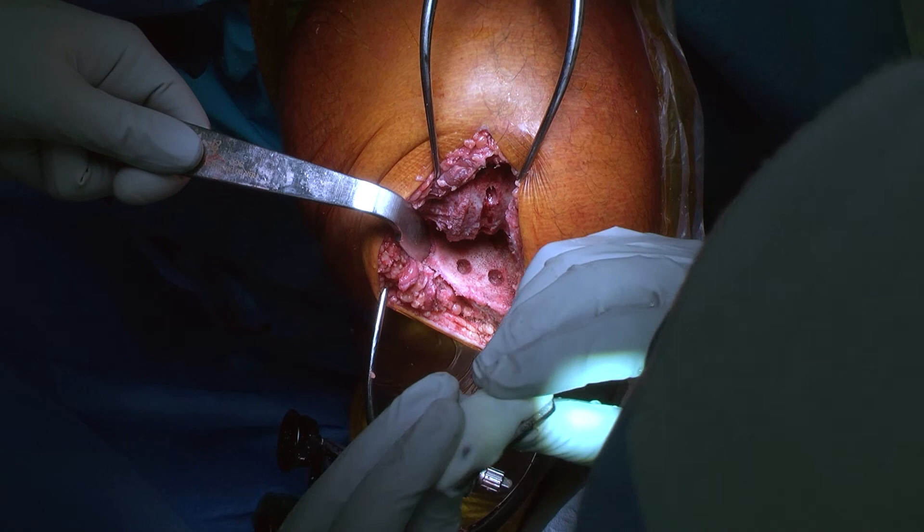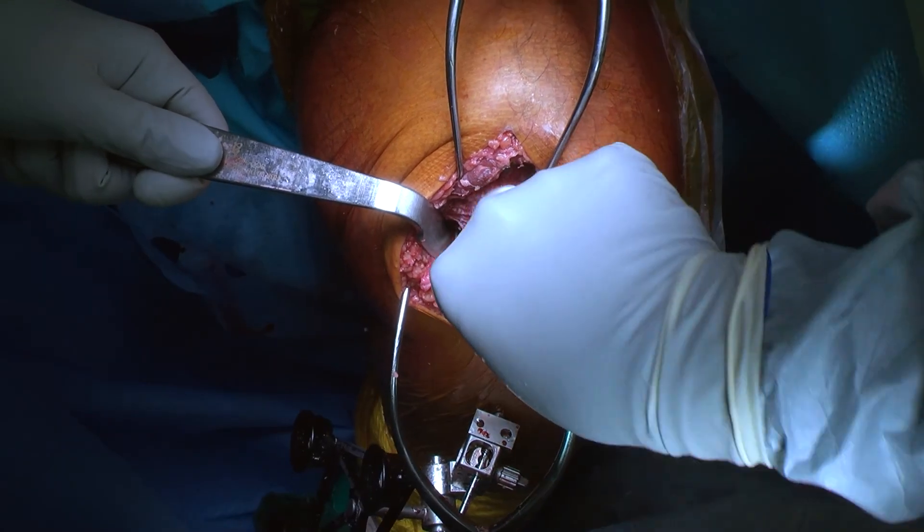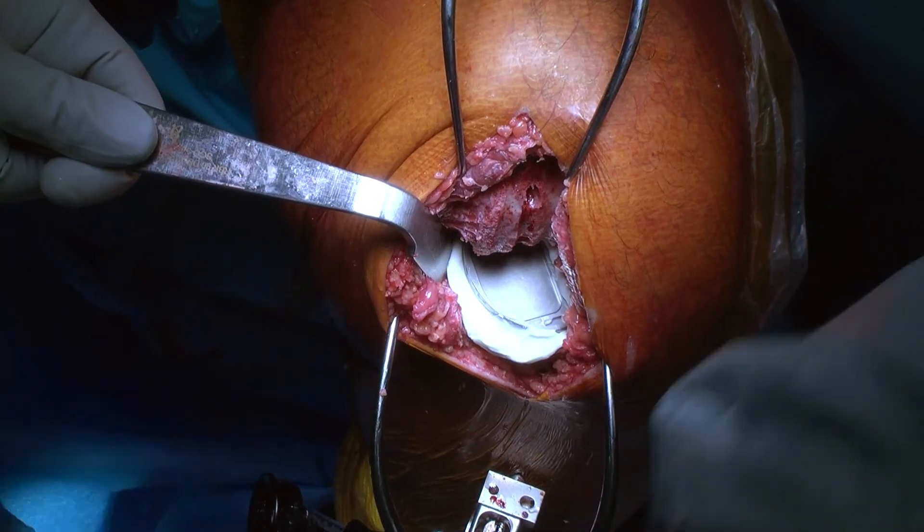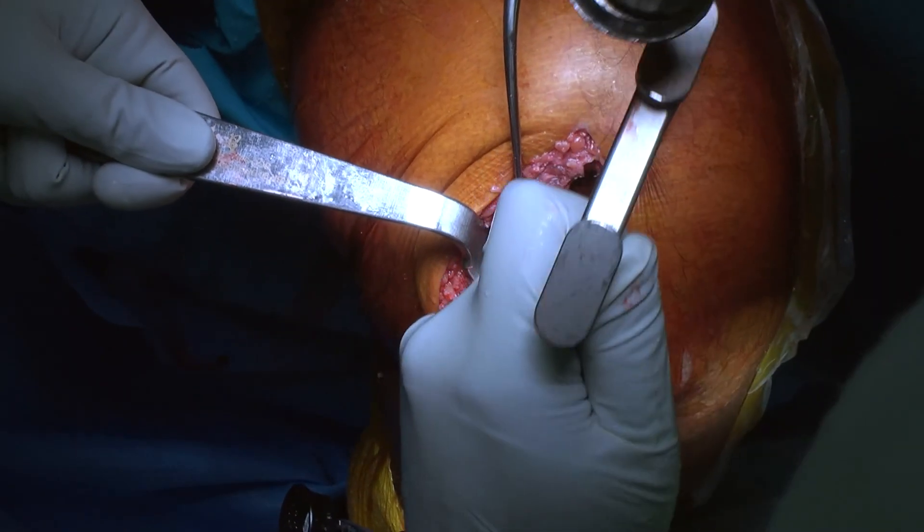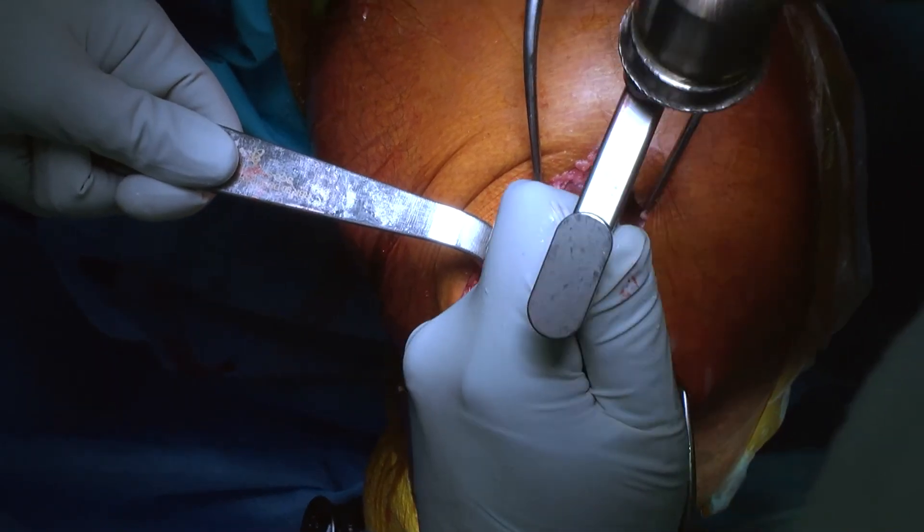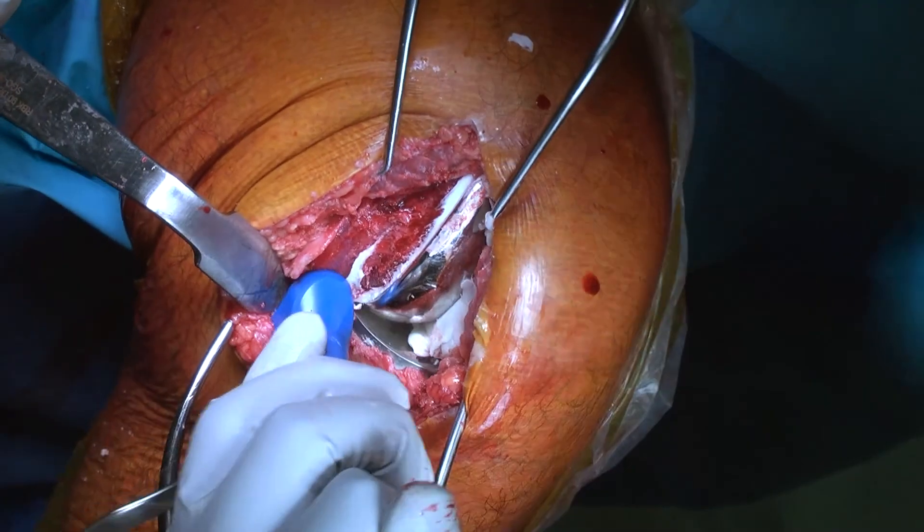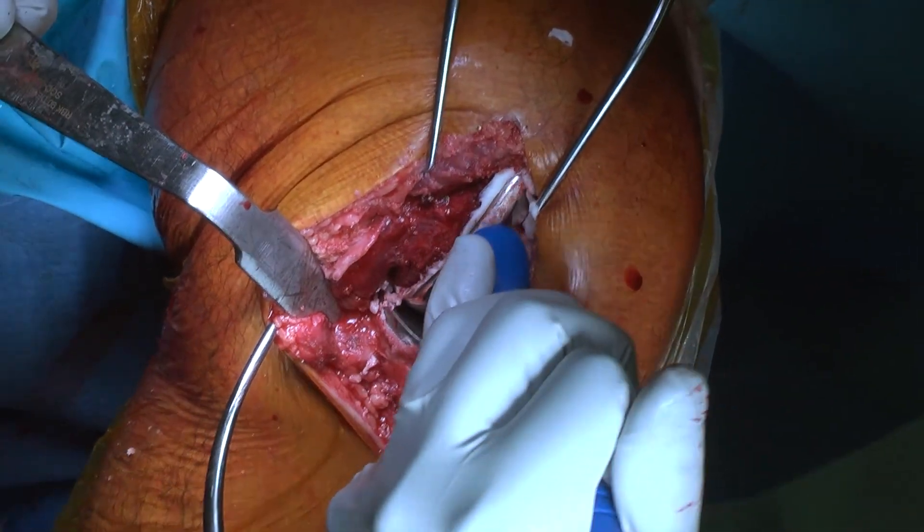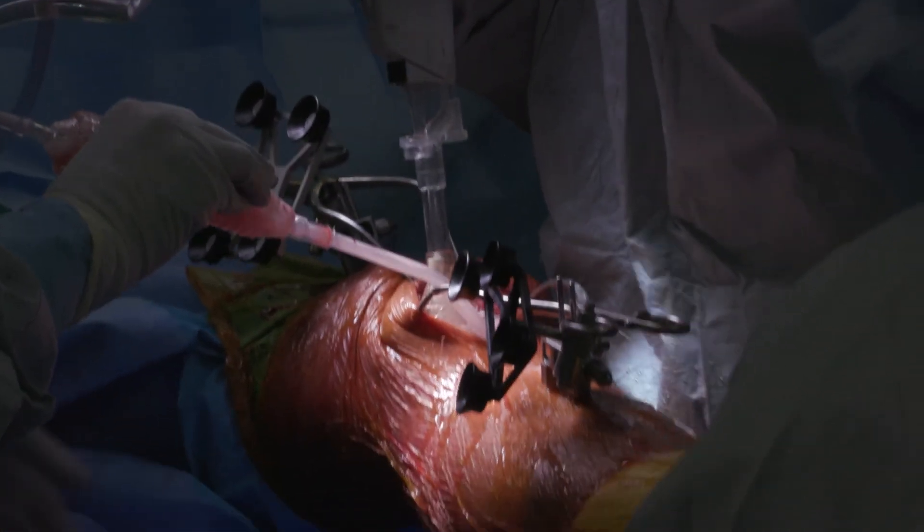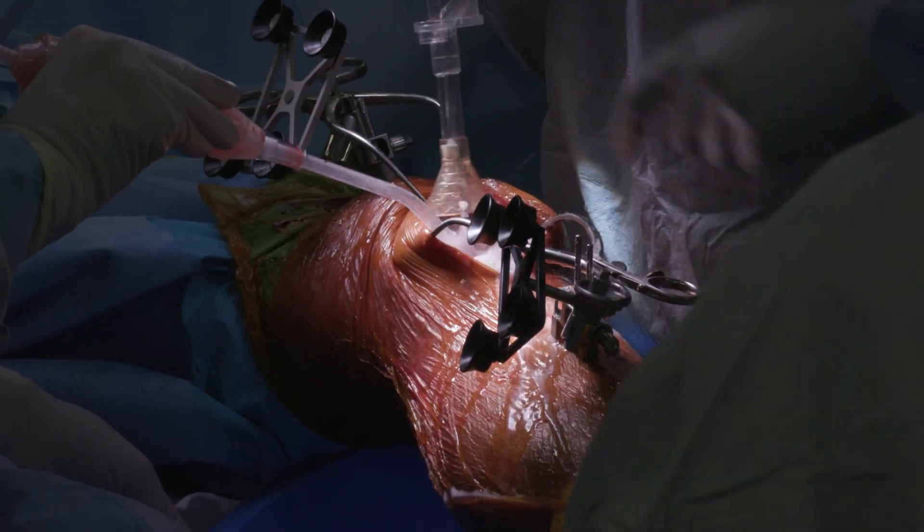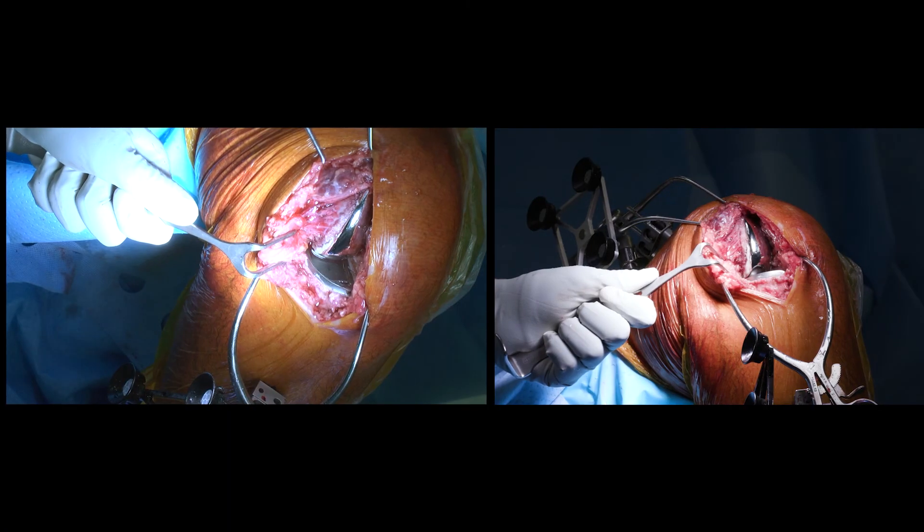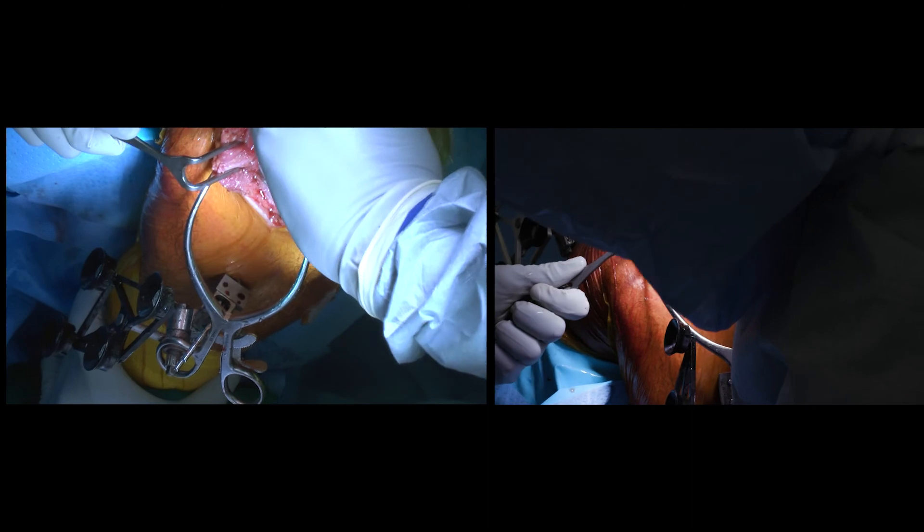The bony surfaces are washed and dried, and the definitive components are secured in place using antibiotic impregnated special orthopedic cement. The excessive cement is removed and the definitive polyethylene liner is secured in place. The knee is then brought into extension and given a very thorough wash using a pulsatile lavage to remove any residual bony or cement fragments.